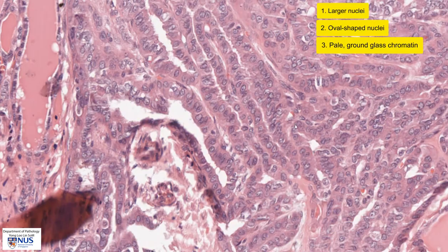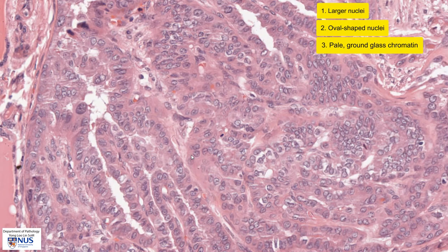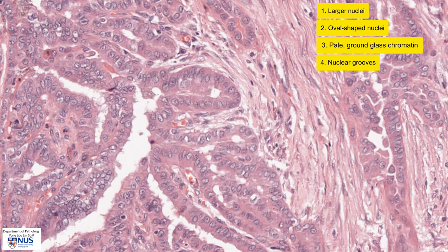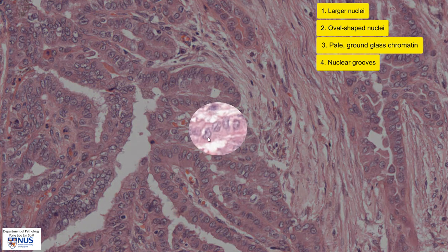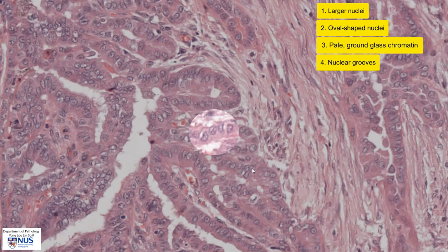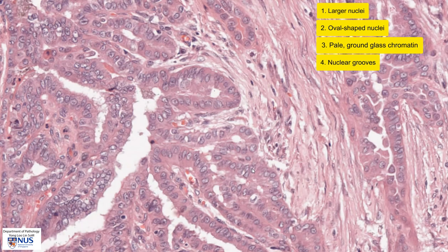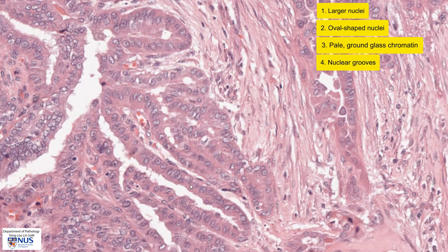Another important feature that we can see is the presence of nuclear grooves. In this area, we can see a very beautiful longitudinal groove running throughout the length of the nucleus, and we can see another one here, and yet another one here. So these nuclear grooves are also very characteristic features of papillary thyroid carcinoma.